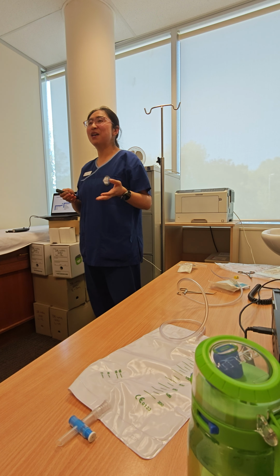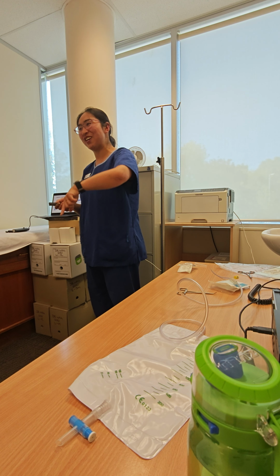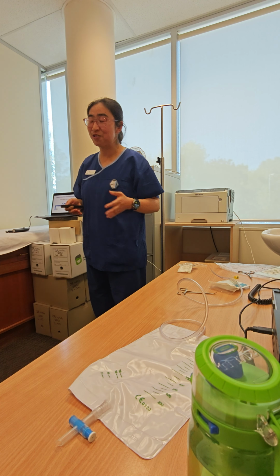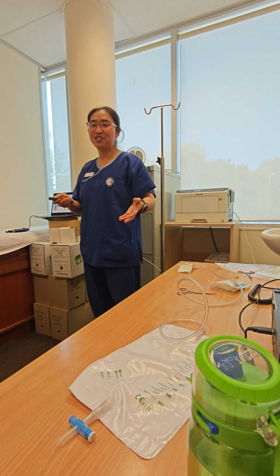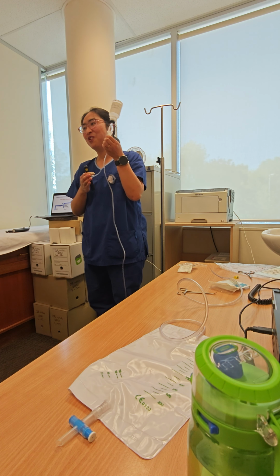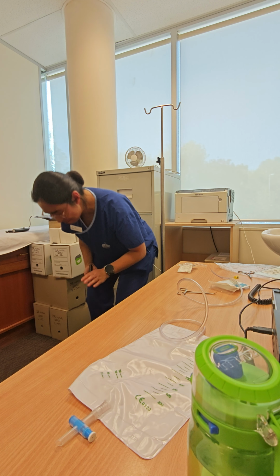Sometimes our doctor is really nice and will wait for five minutes until all the contrast goes through, but sometimes they are not. So you have to think about how to resolve your problem, like changing the needle, or maybe squeezing this one many times to help the contrast go in. That's the way I solved the problem.